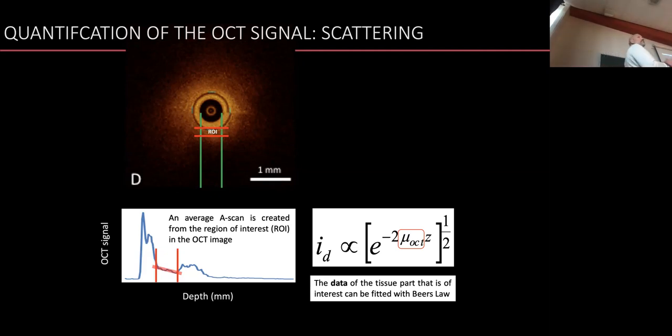So even if you're in this noisy part, you can again have less aggressive and highly aggressive cells there, and both have a different clinical outcome. So having this knowledge is key, and we can analyze this attenuation coefficient. We can already tell the difference between benign and malignant, and that was in 160, 170 patients. We're quite happy there, but now it's important for us that within the malignant group we are able to make a differentiation, and we are not there yet. But using a tool like the attenuation coefficient might actually help us a lot to give us this answer.